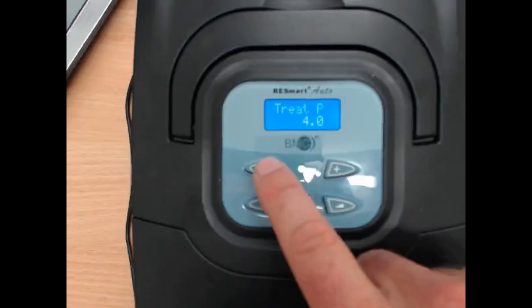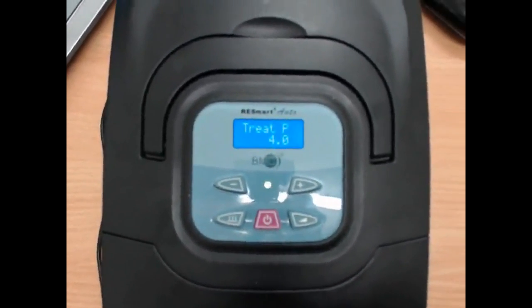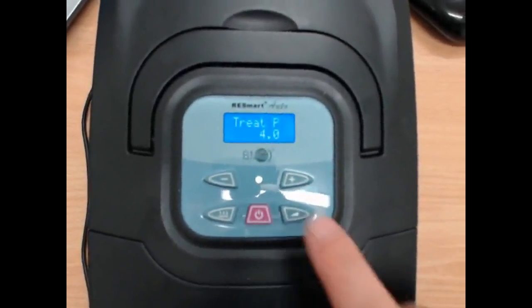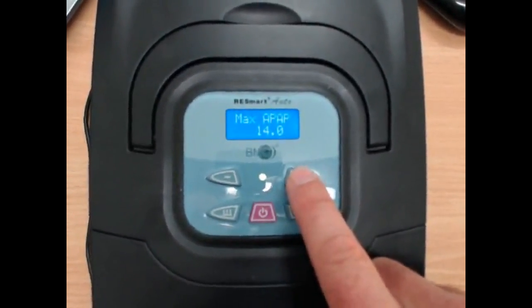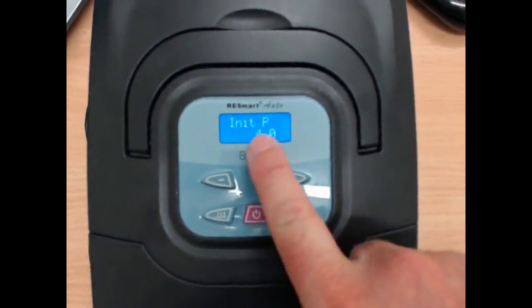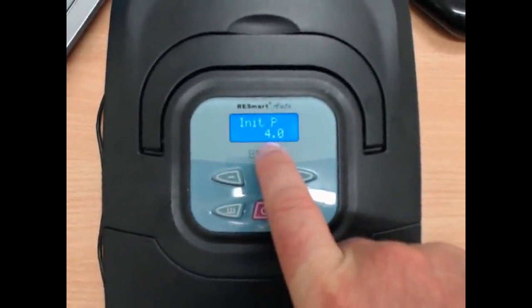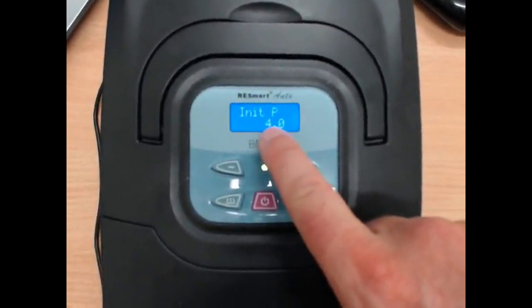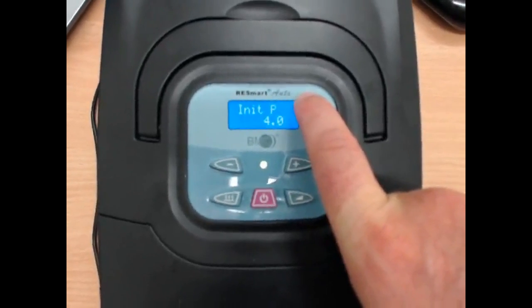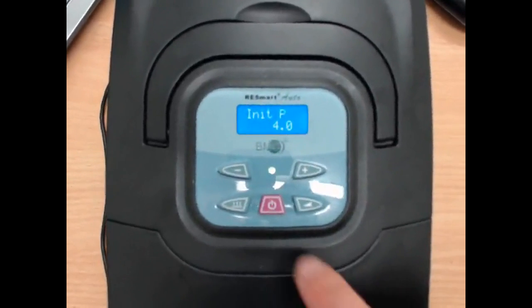So, the treatment pressure is, how do I explain it? Treatment pressure is the, well, let's just start, sorry, I find it hard to sometimes explain. You've got your initial pressure, which is 4. Now, your machine is going to go from your initial pressure, 4, up to your treatment pressure, whatever we've set that to, over whatever we set the ramp period to.